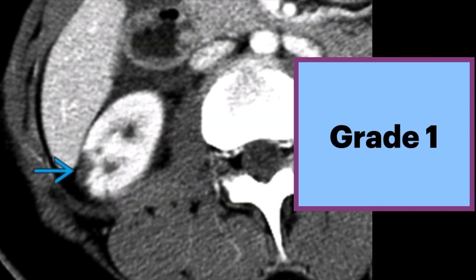Here's an example on this axial contrast-enhanced CT of a teenager. After a motor vehicle accident, there is a small hypodense renal contusion consistent with a grade 1 injury in the right kidney.